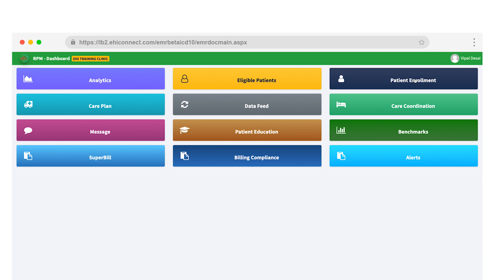And importantly, if you don't have our EHR, our application integrates with other EHRs so you don't miss out. So here's our application. It's cloud-based, so you don't need to download an app on your phone or desktop. You can access it from anywhere, anytime, and most importantly, do it securely.